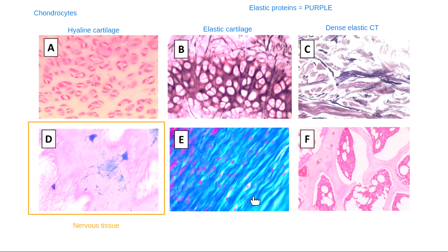Remind me again, what kind of tissue is E down here? What kind of tissue are we looking at down here? Yep, this down here in E is fibrocartilage. Fibrocartilage, my last kind of cartilage tissue. And again, like we talked about, those squiggly blue lines are my fibers that make this kind of cartilage tissue so strong. So fibrocartilage, a very strong kind of cartilage tissue.